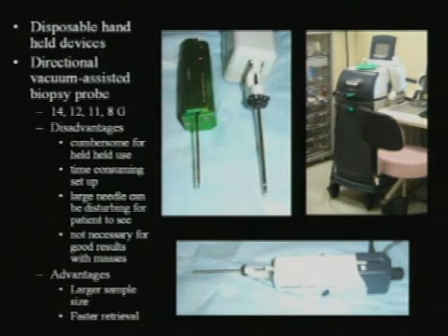However, with ultrasound, we have not really found that this type of device is beneficial because it is fairly cumbersome, as you can see, for handheld use compared to this type of device. It's time-consuming to set up. This large needle can be disturbing for the patient to see, as they can watch the biopsy as they are supine. Also, we get good results with the handheld device and haven't found it necessary to use this type of device. However, when biopsying calcifications and using the stereotactic biopsy table, we do use this type of device.